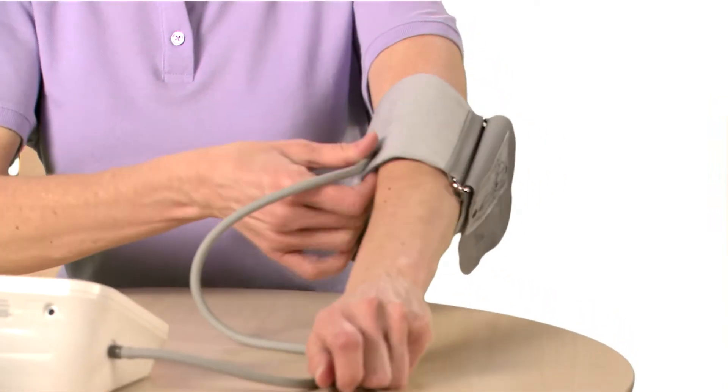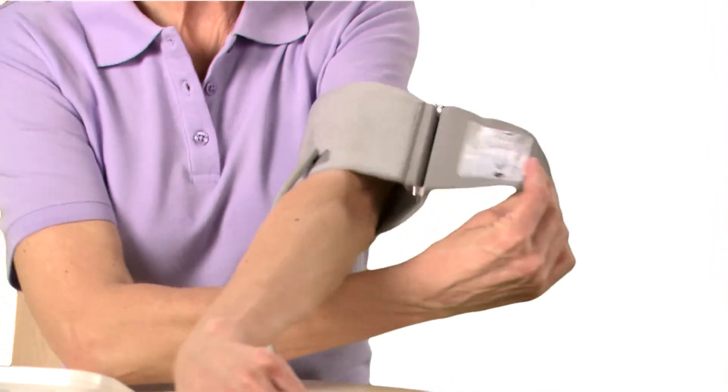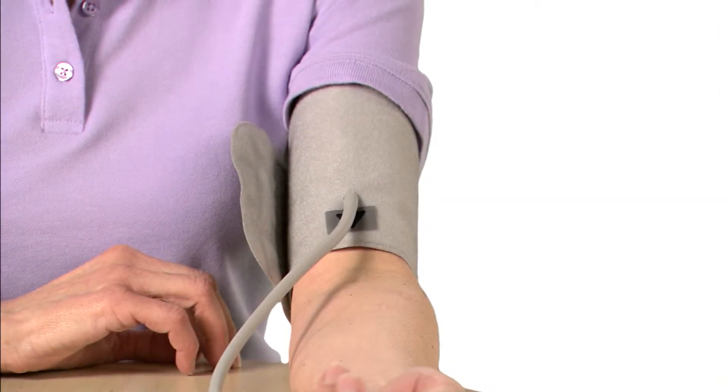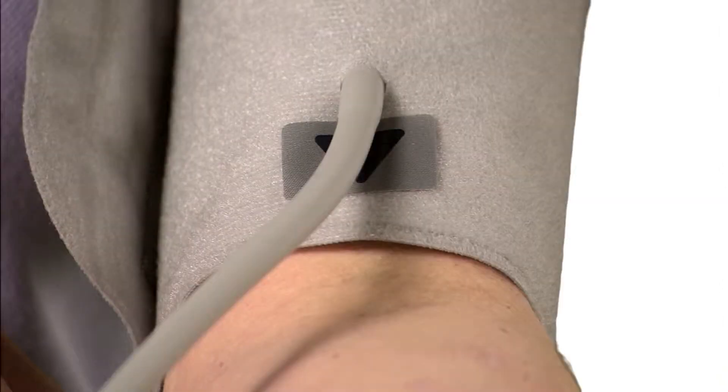Place the cuff directly on the bare skin of your left upper arm. Align the bottom of the cuff approximately one-half inch above your elbow. Make sure the air tube is centered on the inside of your arm with the arrow and tubing pointing down toward your hand.